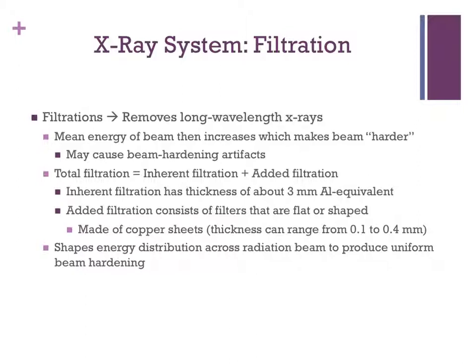Filtration removes the long wavelength X-rays from the beam, and then the mean energy of the beam increases, which makes the beam harder. And this may cause beam hardening artifacts. Remember, beam hardening increases the average energy of the X-ray beam by filtering out those low energy photons.